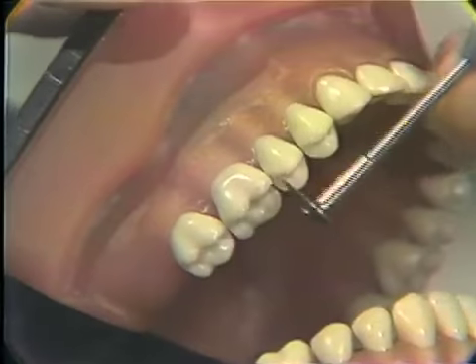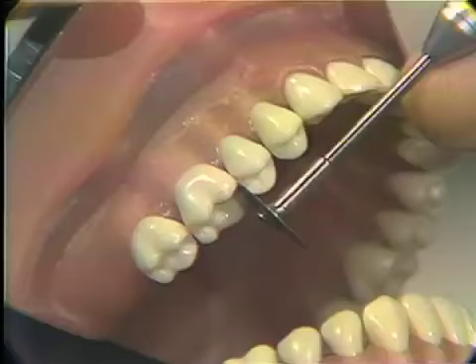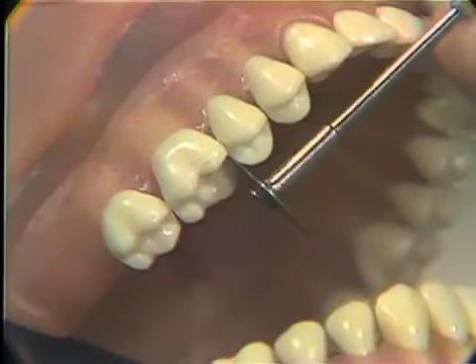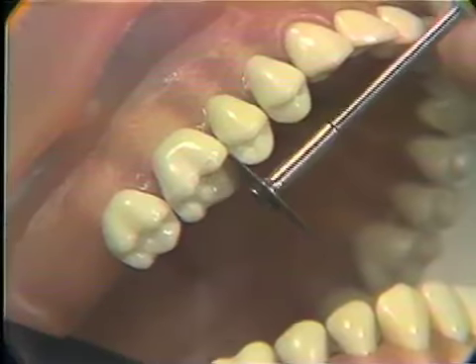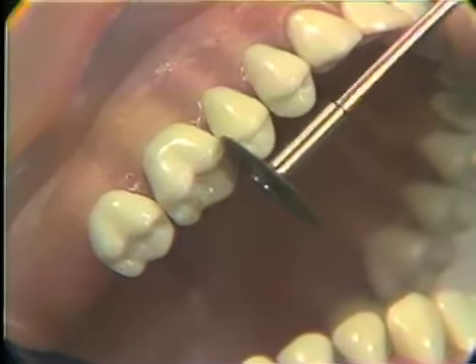Now also check the lingual, because we are going to be slicing individually. As you come into the lingual, you will notice that there is more freedom here. It does not catch. So that means that we practically are out to where we have to be so that the disc will go through freely.